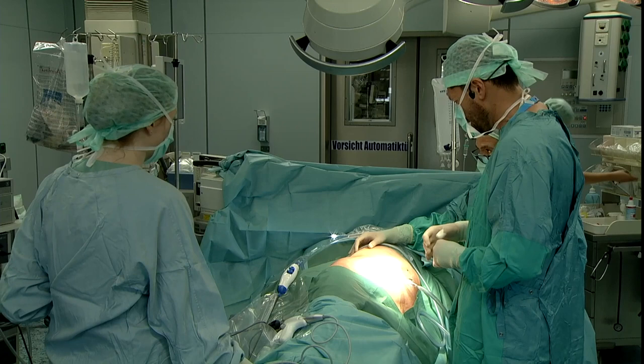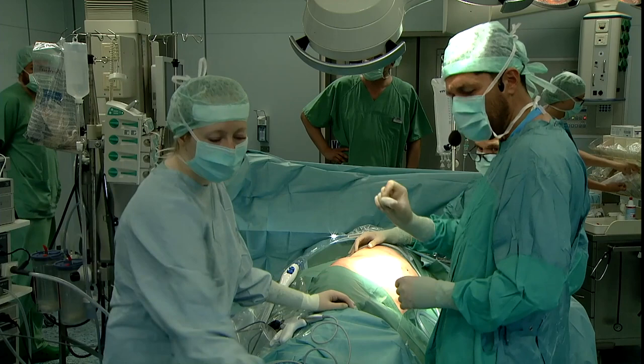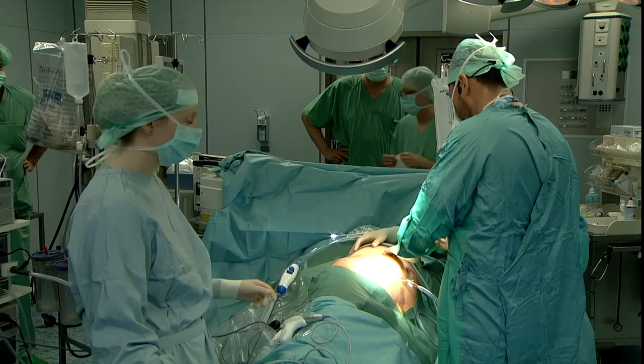And the way I normally perform this is with the trocars in a line position. Do we have a marker, a pen? There you go. So I do it a little bit differently than what regular and standard laparoscopy has been taught.